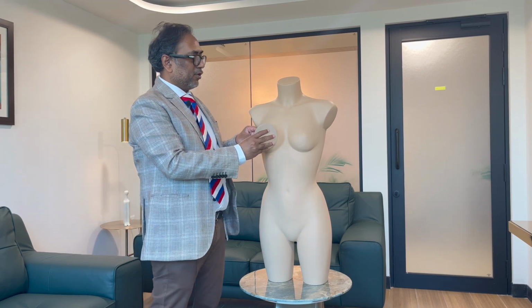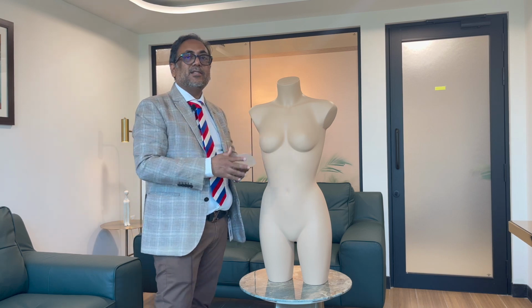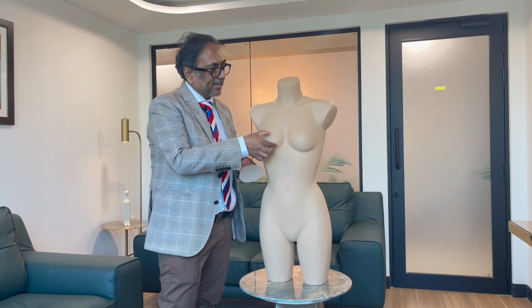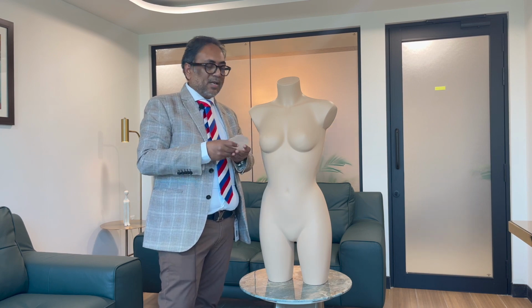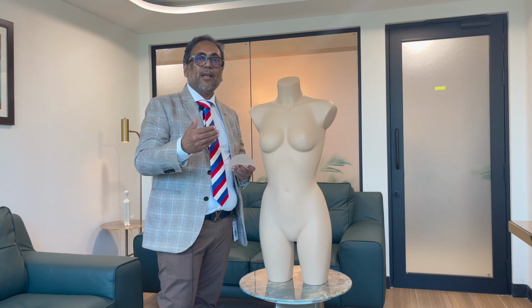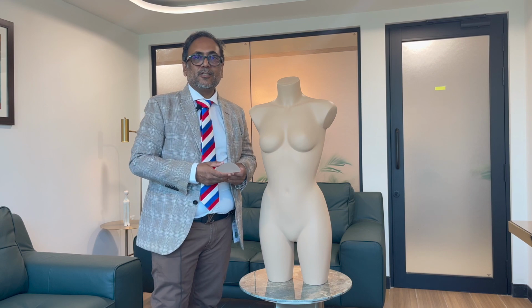We also try to see if the projection of the implant is actually suiting the patient's requirements. And since we have also taken the skin envelope stretch, we also know that it can accommodate that kind of projection. So it's all about marking up the patient and going back to the catalogs of our implant companies, which help us in choosing the right size of implant, and thereby matching the patient's expectations for a breast augmentation.